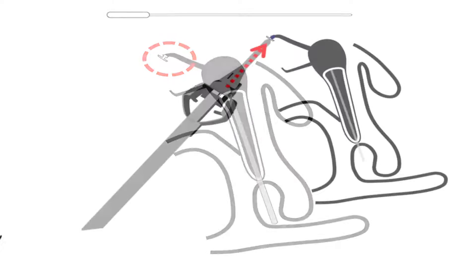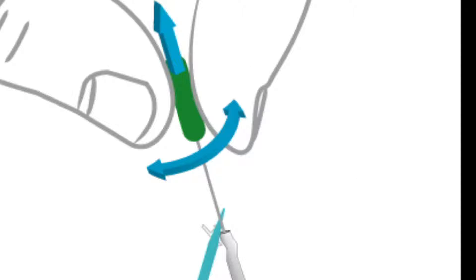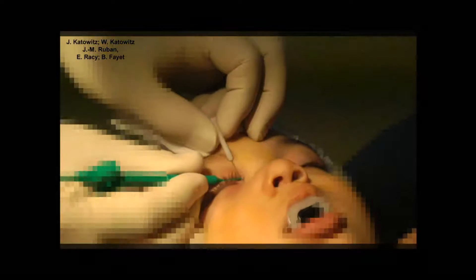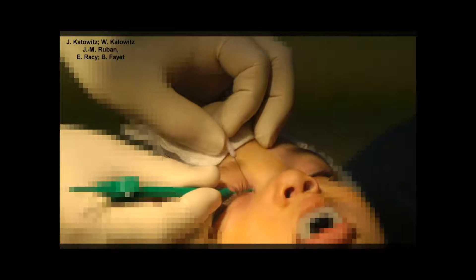The insertion guide must be removed very carefully. The fixation head should be kept in contact with the punctum by pressing the fixation head against the punctum using one end of the FCI dilating insertion instrument. Use of forceps should be avoided to prevent harming the delicate silicon sleeve. Rotating movements of the guide back and forth, like winding a watch, should be done very slowly with upward traction, millimeter by millimeter, while the guide and silicon sheath remain in the vertical axis of the nasolacrimal sac and duct.